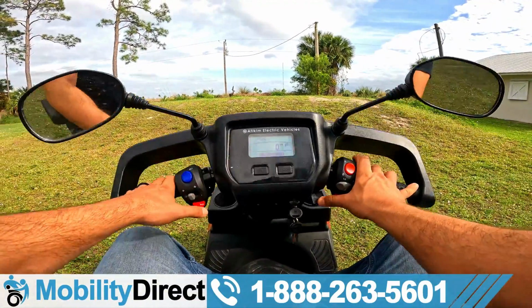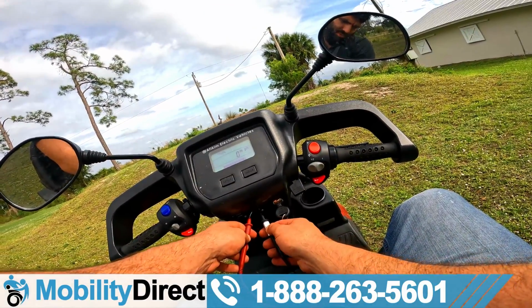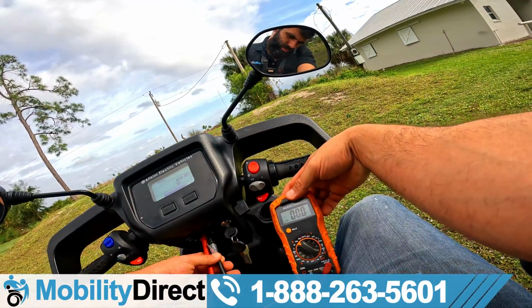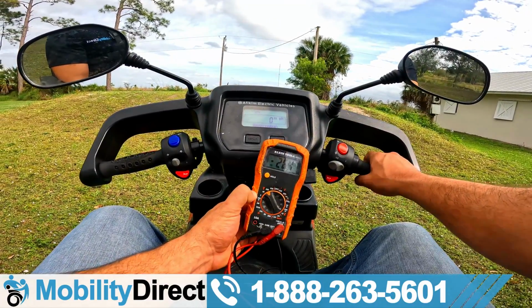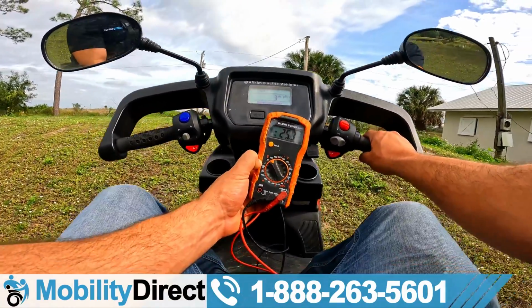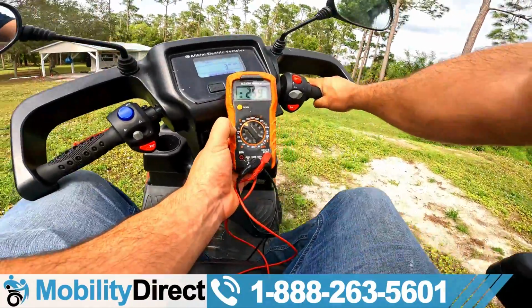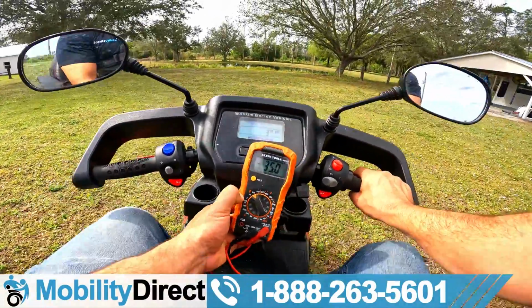I'm gonna bring the tiller all the way down so you can see what's on the display here. Put my multimeter back in the charging port, the probes there. Okay. All right, so here we have 26.4. Let's go up that hill one more time. I'm gonna go nice and slow to really get it to drain. 24.9. Now when I was going faster, it went down to like 24.2 and then it cut out. So I wanna say maybe that's why it cut out at that exact moment.